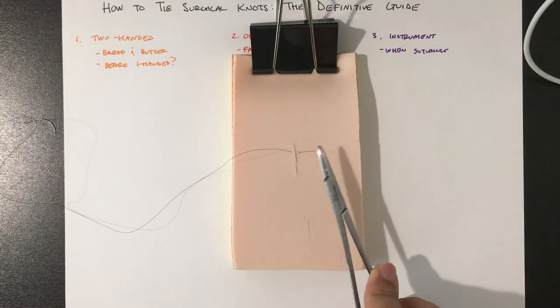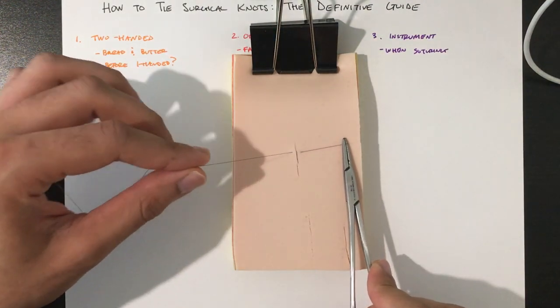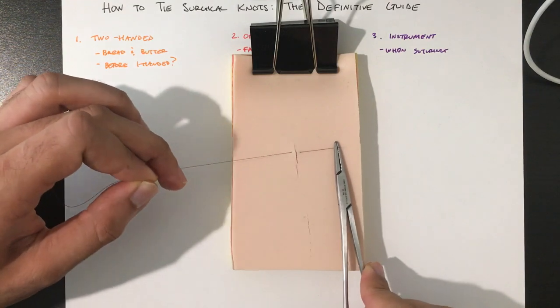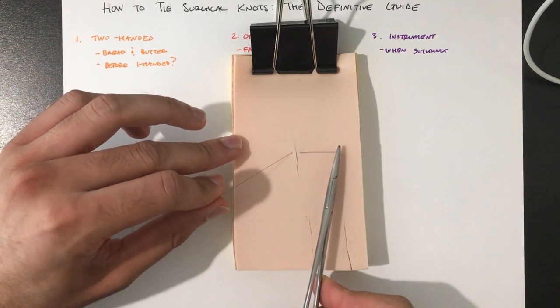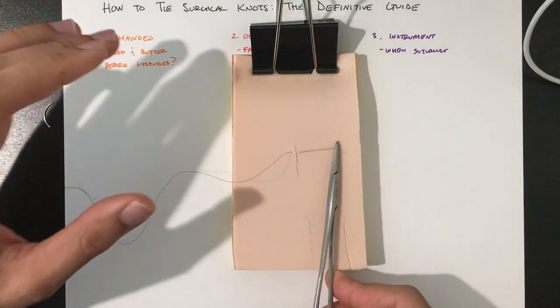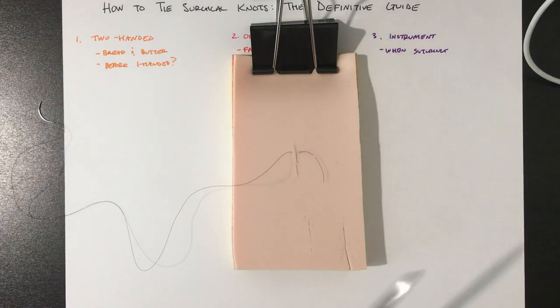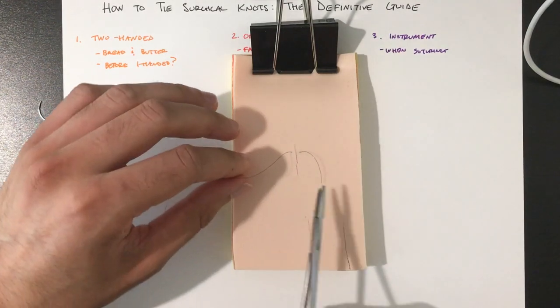So next is the instrument tie. Here I have laid down my suture. A common mistake people make is they'll keep the short end too long. You actually only want this about one, one and a half inches. If it's too long, it actually makes it more difficult.